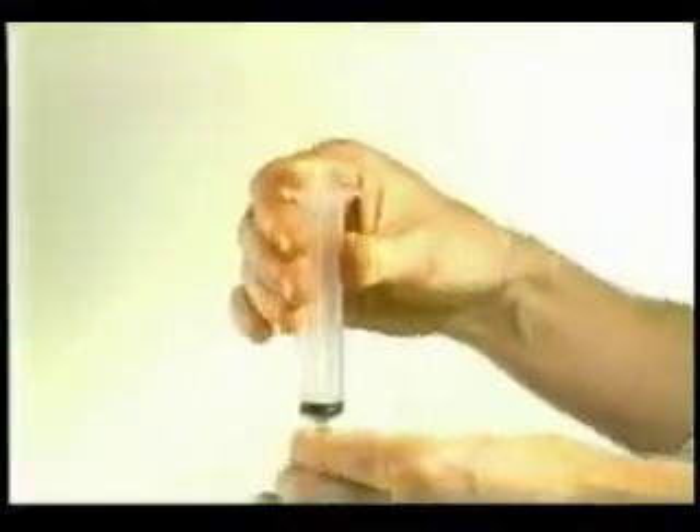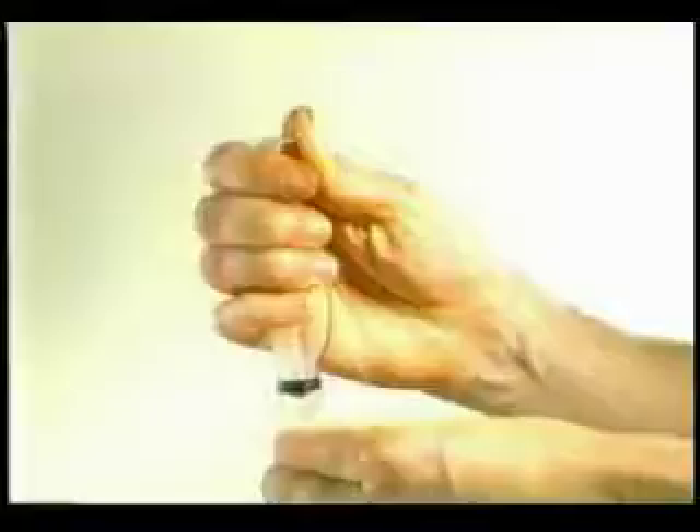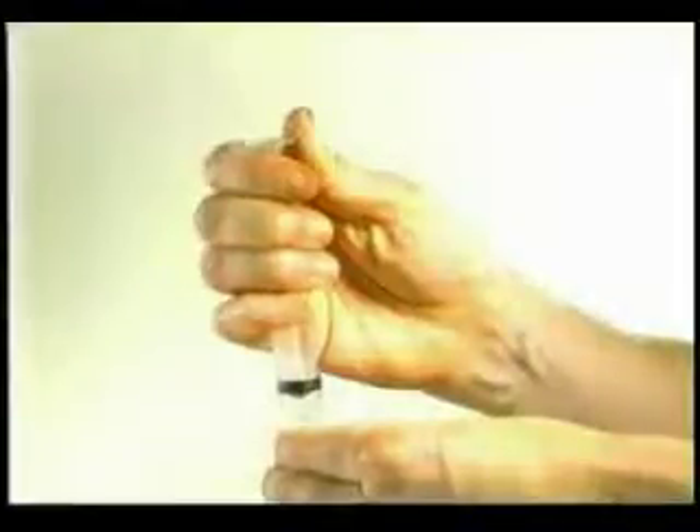Once the needle is confirmed in a good position, the stylet is removed and the syringe is attached. A syringe holder is usually not needed. Instead, the syringe may be held like this. In this position, the plunger can be easily pulled back and held in place during the sampling. Remember that a small amount of suction is enough. With the suction in place, the attention can now be turned to collecting the sample by moving the needle back and forth.